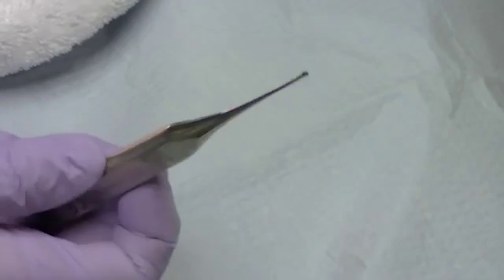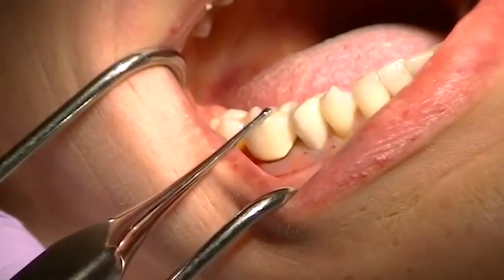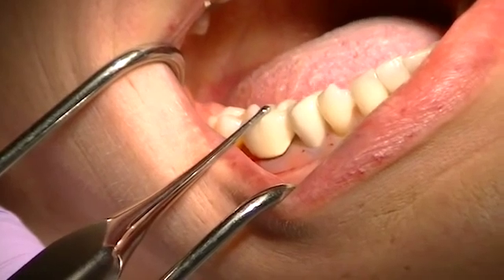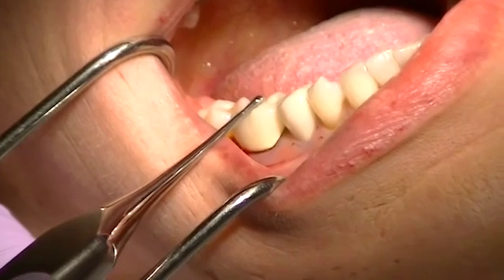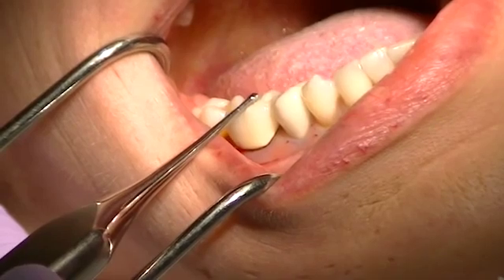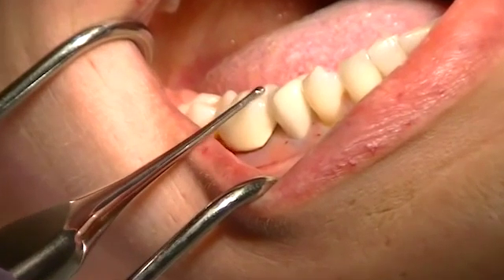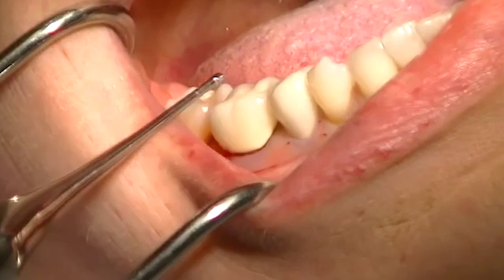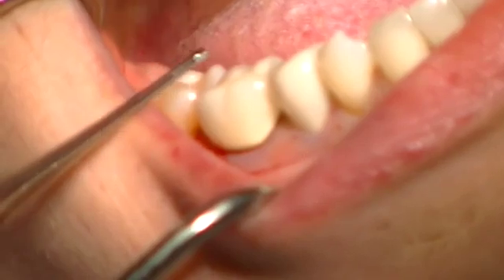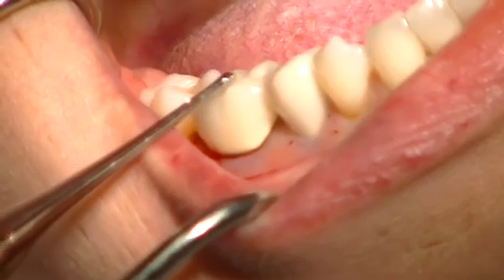What we want to do is make a preparation on the facial aspect of this crown — a small elliptical hole — and penetrate through to the occlusal table. We assume that the preparation of this crown is on the occlusal one-third of the crown. So I'm going to make an elliptical opening in the facial aspect so that I can place the ball of the Whamkey through that little hole onto the occlusal table by the central groove area, and then simply rotate that crown off. This is a wonderful system.